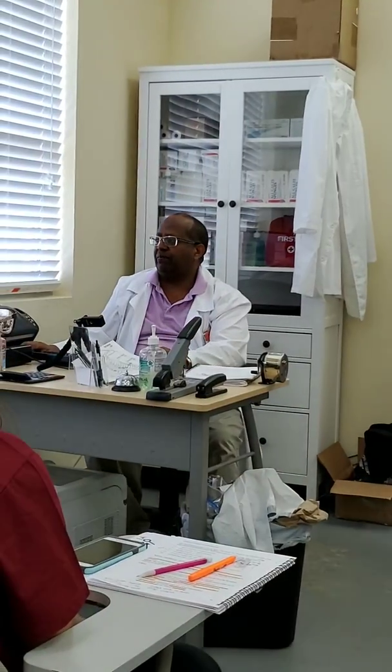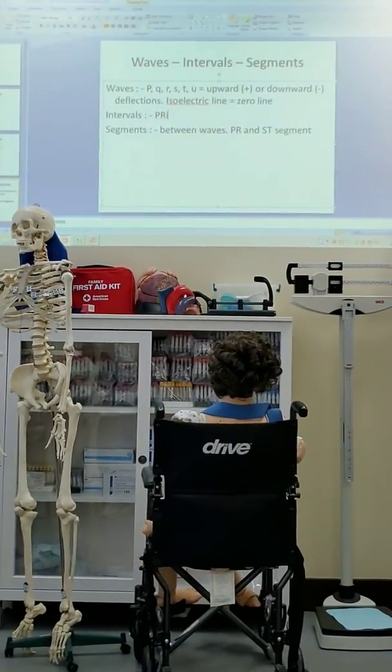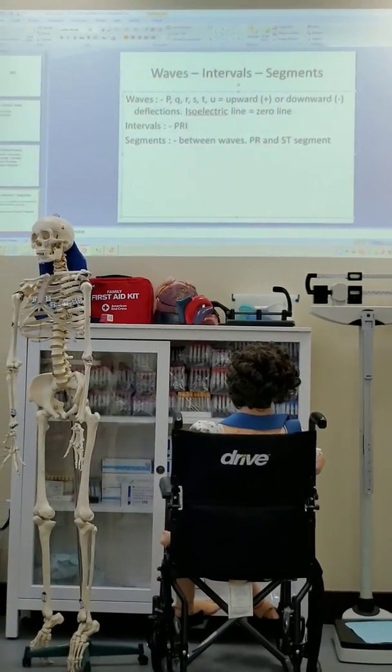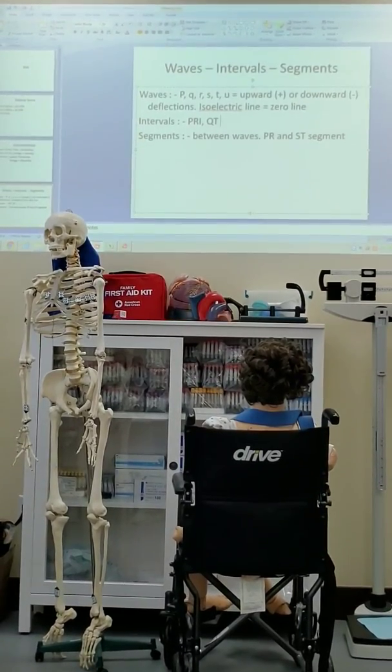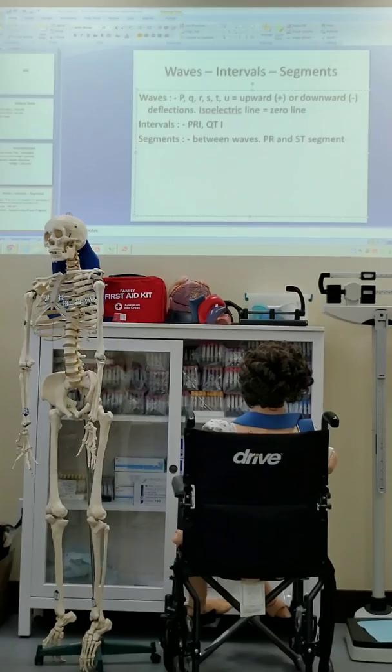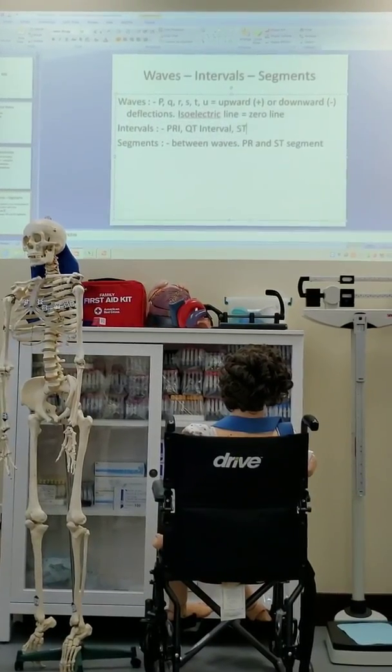So intervals can be the PR interval, usually termed PRI. You also have the QT interval, and the ST interval.